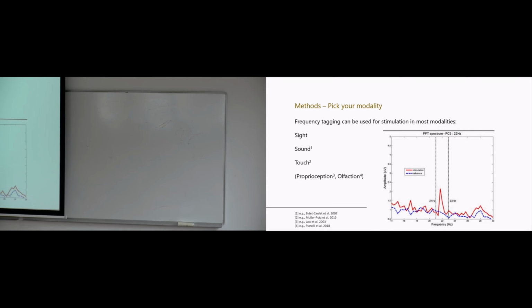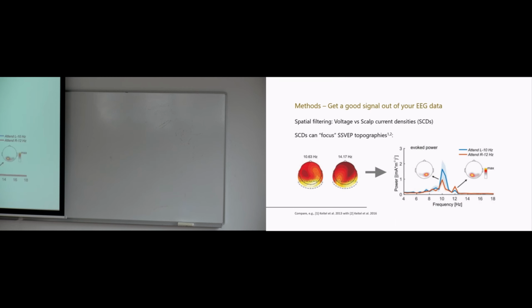So what people are usually doing with the regular stimulation lends itself to later using spectral decomposition, right? So you know something is going on rhythmically, so that means that you can look at your EEG data using a very similar approach, and then you get a peak in your spectrum. One thing that is going to be interesting later on is that this shouldn't be taken as a sign that there is something oscillatory going on in the signal. It just means that there is something periodic in the signal, okay? And I hope the difference becomes clear later on as well. I just wanted to mention it here because I felt it is worth it.